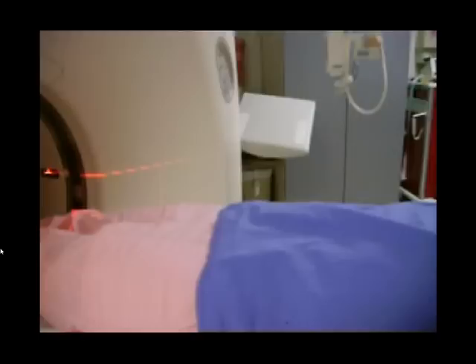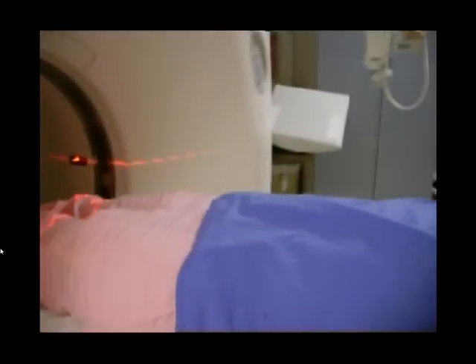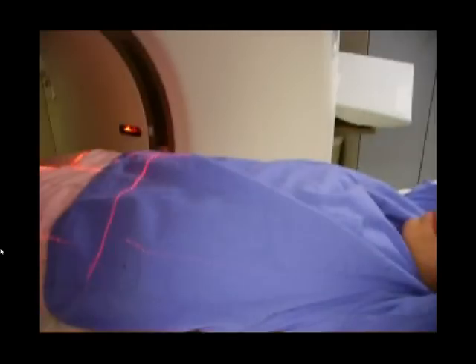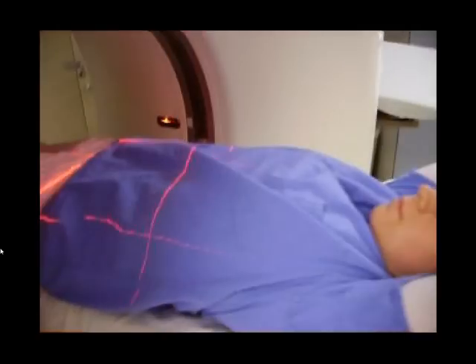Now, the first position I'm actually going to show you is for the abdomen and pelvis. I will go on up and show you where you set for the chest, but the mark for the abdomen and pelvis is actually going to be at the xiphoid tip. Now make sure when you go to feel for the xiphoid tip, you let your patient know, I'm going to be touching you.